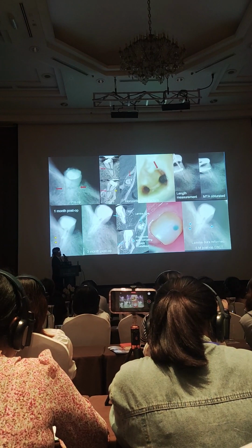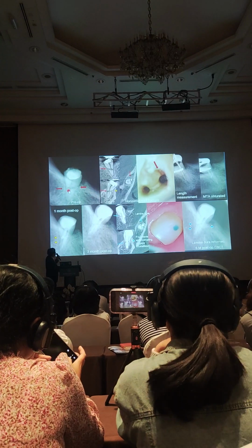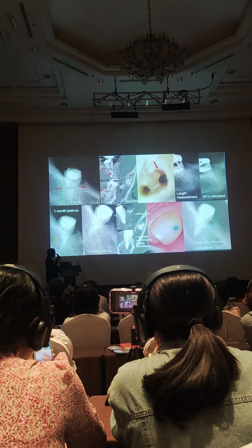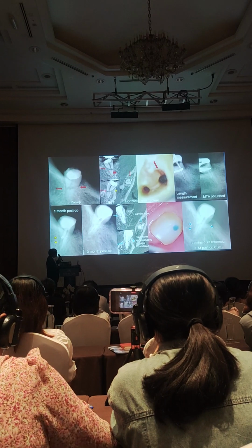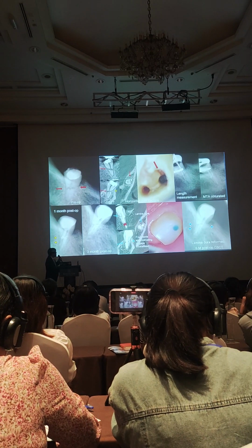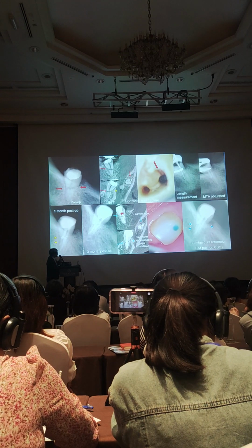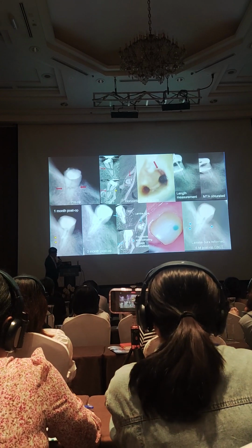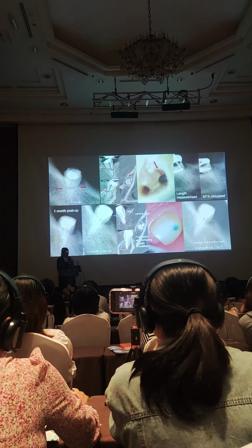Another case, you see horizontal root fractures here. Oh, I found my cursor. So here is a horizontal root fracture. You see, this is a CBCT image. You see the horizontal root fracture very, very clearly. Then what I did was simple. I obturated the canals because the fracture, as you can see, is under the crest bone. Everything happened in the bone. So that's why if you remove bacteria, you can fix this problem.